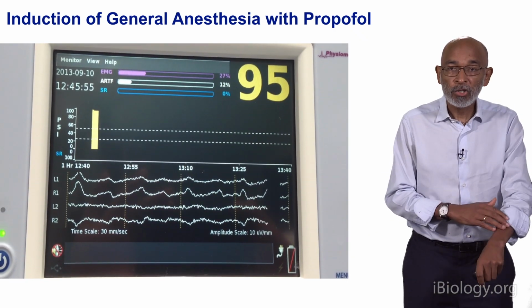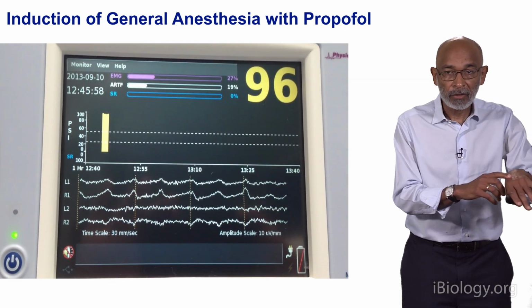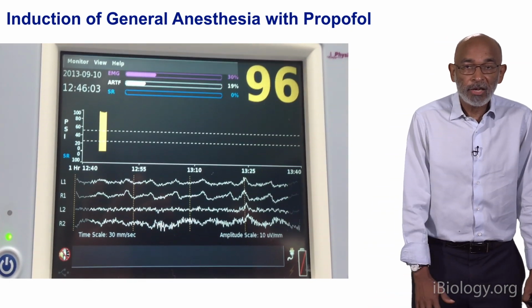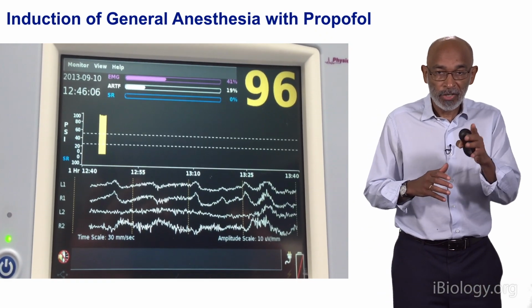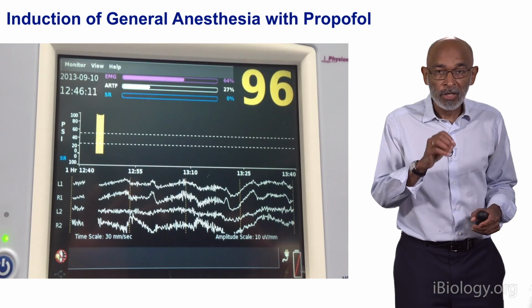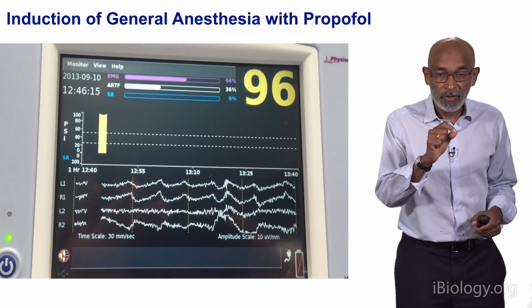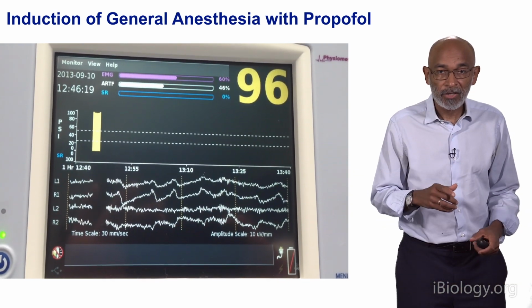And propofol burns when it goes in, particularly if you inject it into a small vein like the one on the back of my hand here. So that's what's happening. And so she's tensing up like this. She's tensing up. And you see there's a lot of noise. All right? Now that's actually going to be good from a pedagogical standpoint because you're going to be able to see exactly when the drug takes effect. So give me another 6 or 7 seconds here. So look at all that noise. She's tensing up.